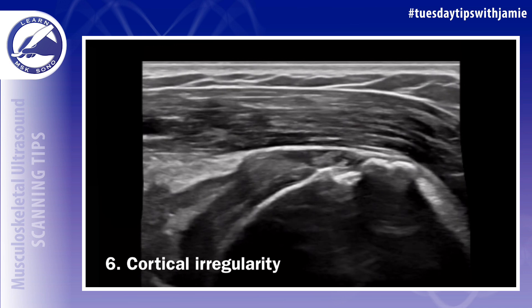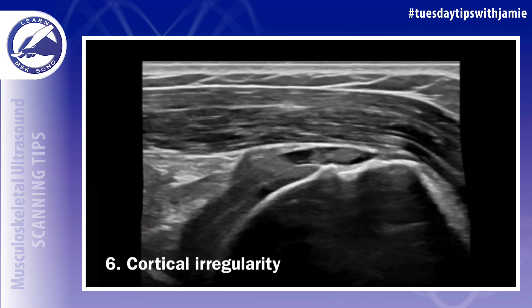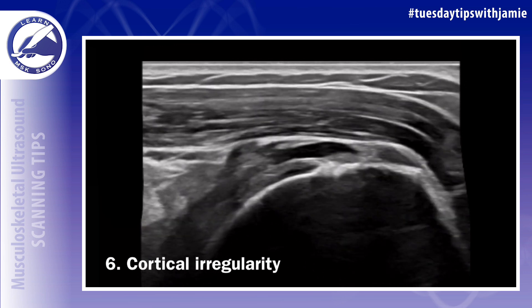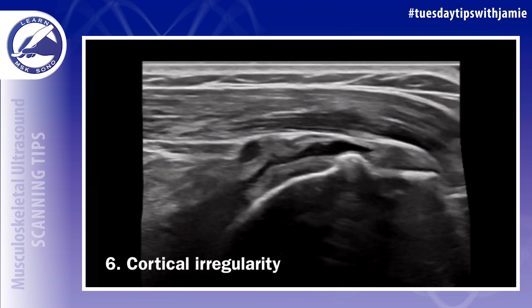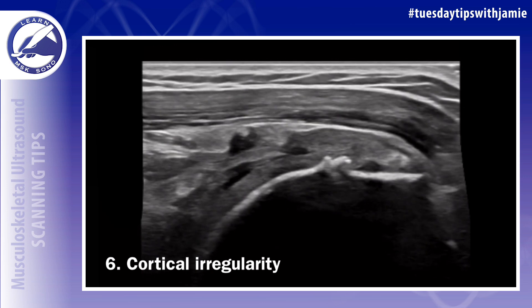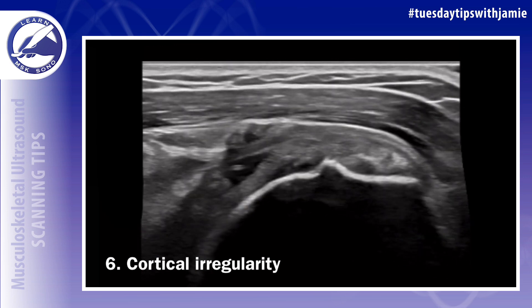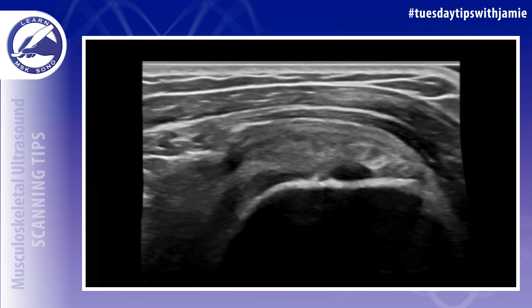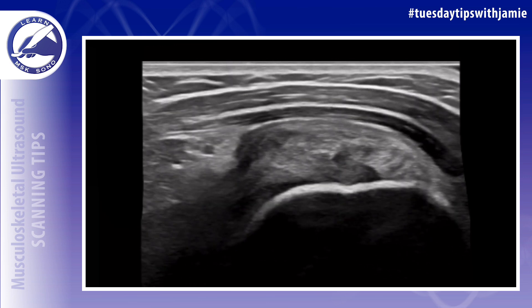Number six: cortical irregularity of the greater and lesser tuberosities are often associated with rotator cuff tears, changing the appearance of the normally smooth bone contour.